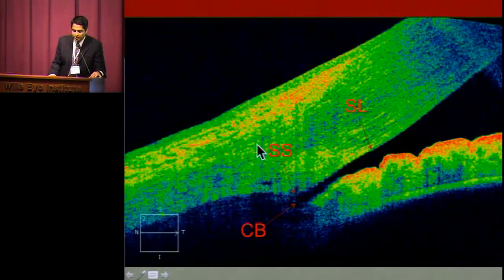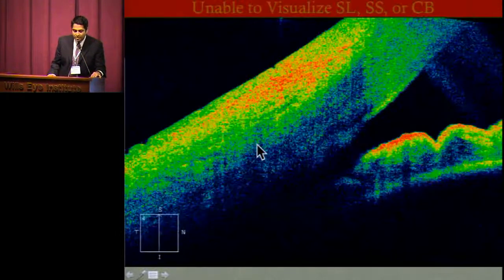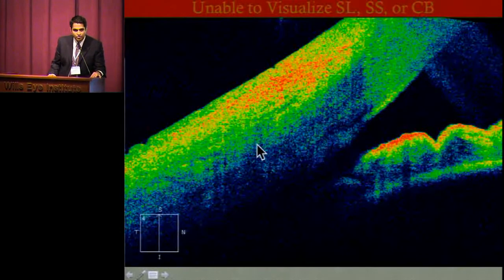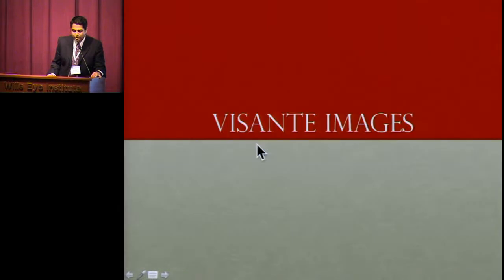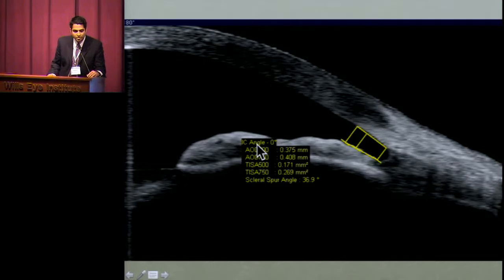Looking at sample images: in the Cirrus, structures such as Schwalbe's line, the scleral spur, and ciliary body band can be very nicely identified in good images. But in other images, these structures were less identifiable. The Visante comes with calipers for parameters such as AOD 500. However, up to 40% of Visante images also had structures that were not clearly delineated.